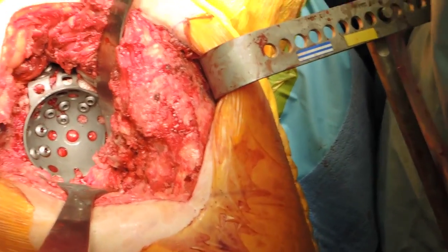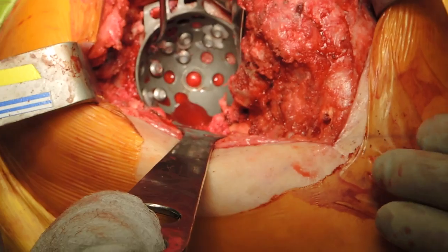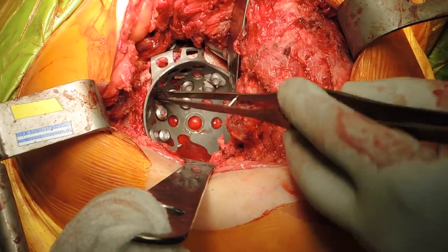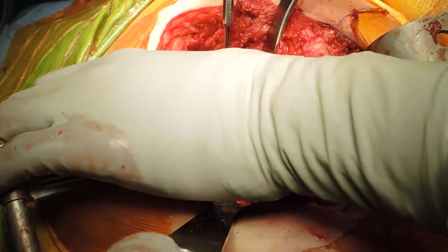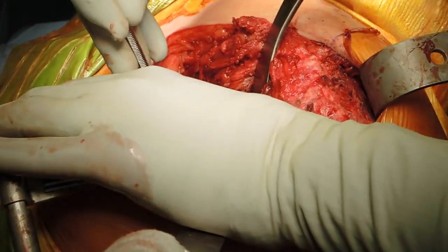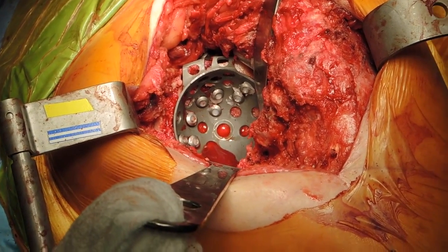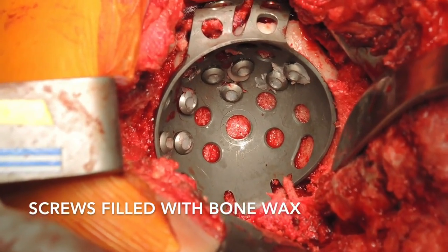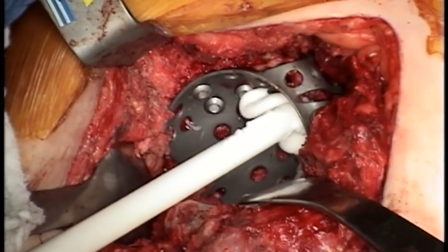We'll go ahead and film this. I'm just putting wax in the screw holes. I have had the opportunity to come back and take these cages out on occasion, so you always want to make sure you have access to the screw holes, so the cement doesn't get in there. This is a final picture of all the screw heads filled with bone wax. In this view from the overhead camera, we've finished applying all the bone wax to the screws.